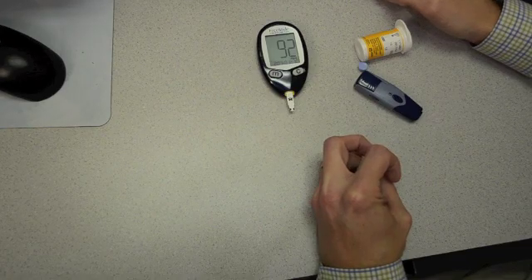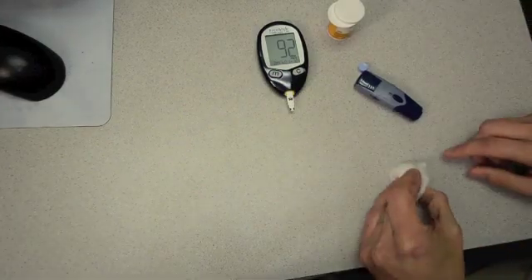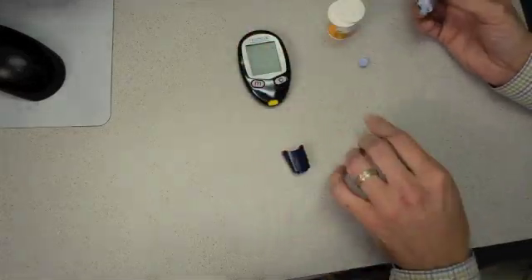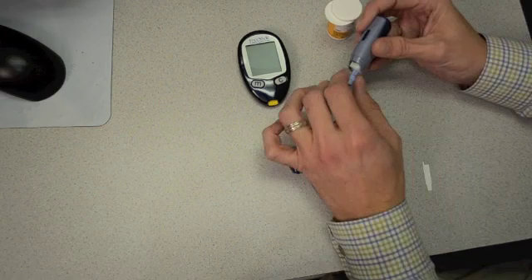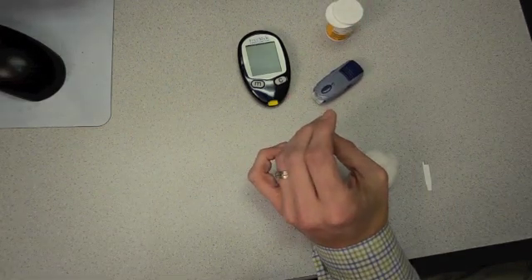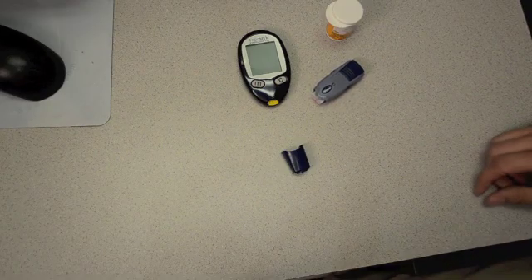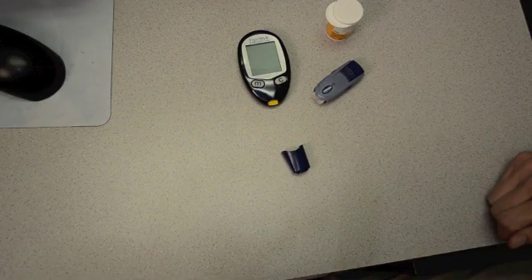That's all there is to doing a good, virtually pain-free stick — that's the proper technique. After we're done, use the cotton to apply pressure to your finger so you stop bleeding. The test strip can be removed right into the trash, and then we've got to dispose of our needle. I keep the safety cap around — it allows me to push the needle right back into it, remove it from the lancing device, and then it goes right into a sharps container. Sharps containers are the safest way to dispose of needles, but if you don't have access to one, you can use an old laundry detergent bottle with thick plastic — just mark through it so no one tries to use it for actual laundry.